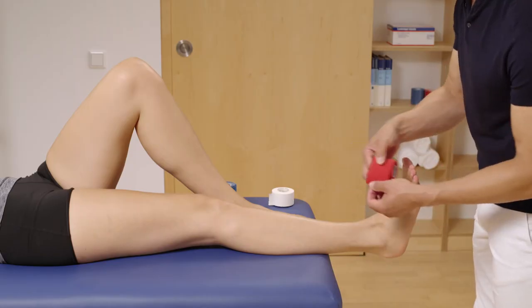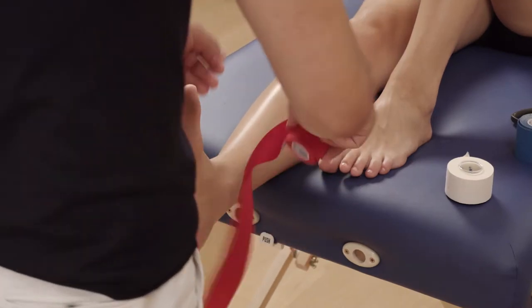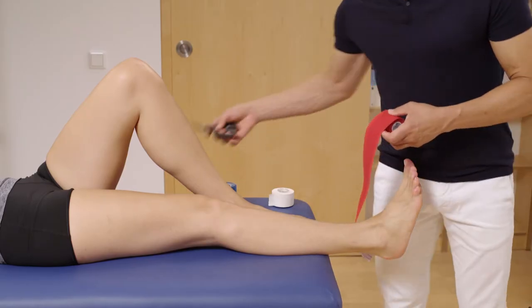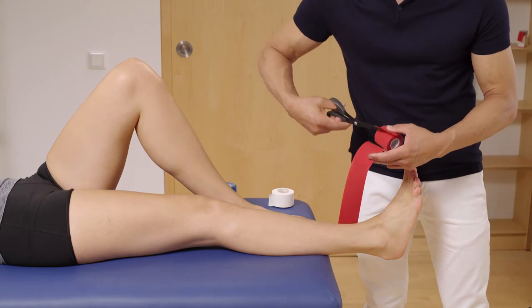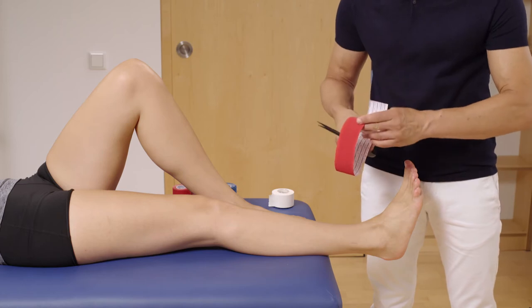Take a roll of LoicaTape K and measure the length around the foot from the medial to the lateral side at the height of the calf muscle insertion. Cut off the tape, lay the tape halves on top of each other and round off the ends.